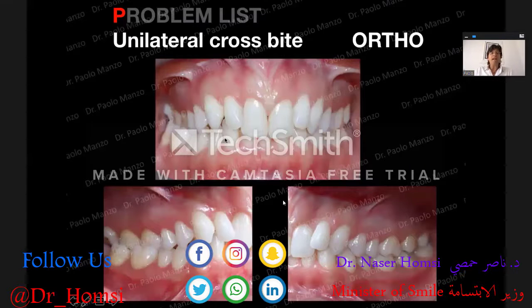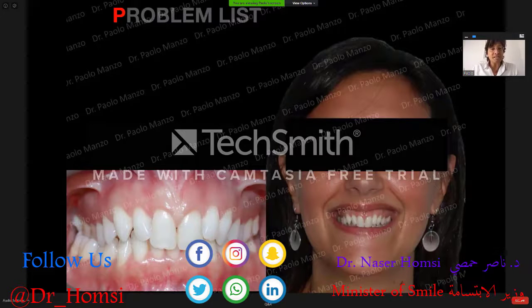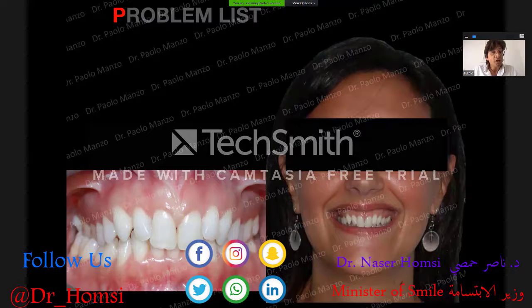Now, I like to move from diagnosis to the treatment plan by going through the problem list. If we check the problem list here, we have the unilateral crossbite, and this is one of the problems we have. But we also have a deep bite, and this deep bite is not only a dental problem, because it is strictly connected with the gummy smile. So the amount of gummy smile, the kind of deep bite, and the divergence of the patient can affect a lot the way we want and we can correct this deep bite and this gummy smile.